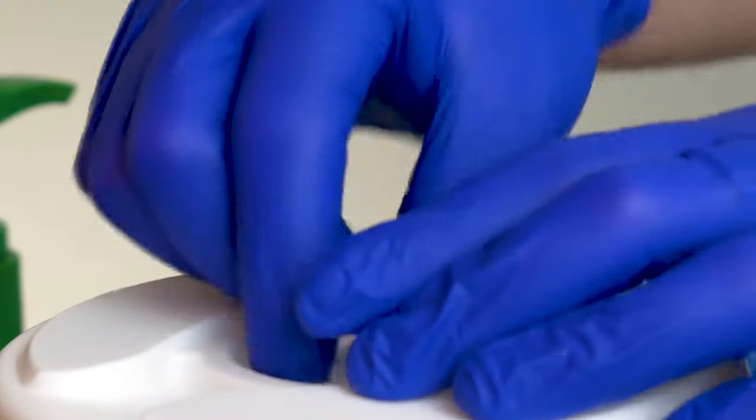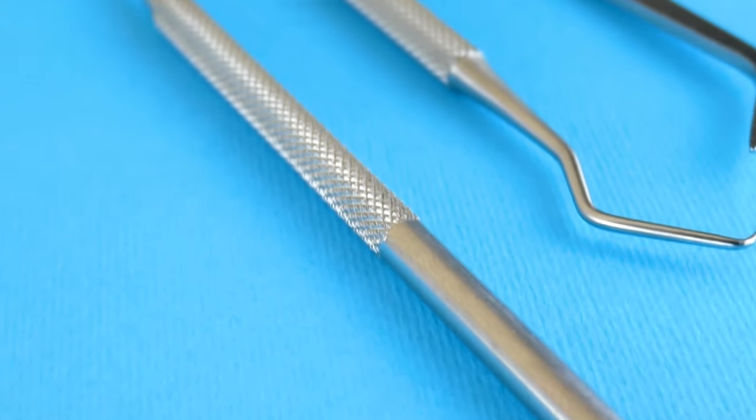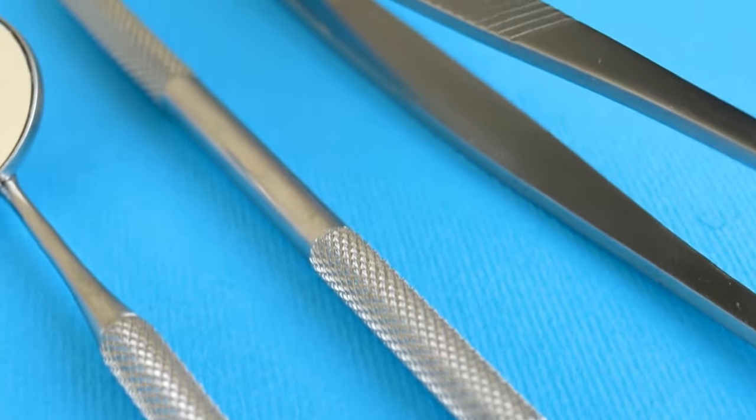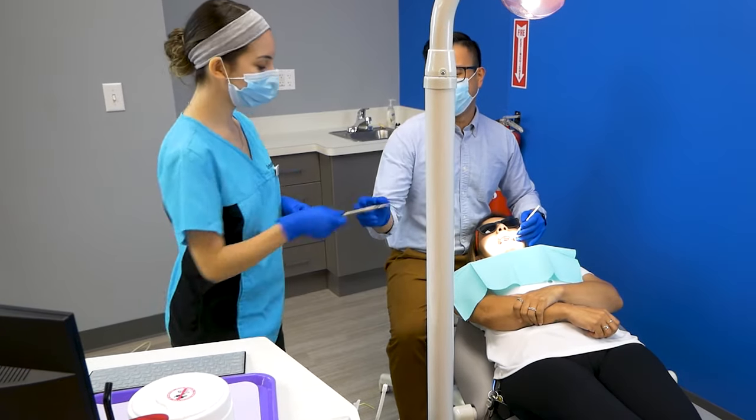The sterile tech puts patient health as a top priority. One of the ways they do this is by making sure all orthodontic instruments are sterilized before being used by assistants or doctors. After an assistant is done with an appointment, they will bring the instruments on a tray to the sterile tech.